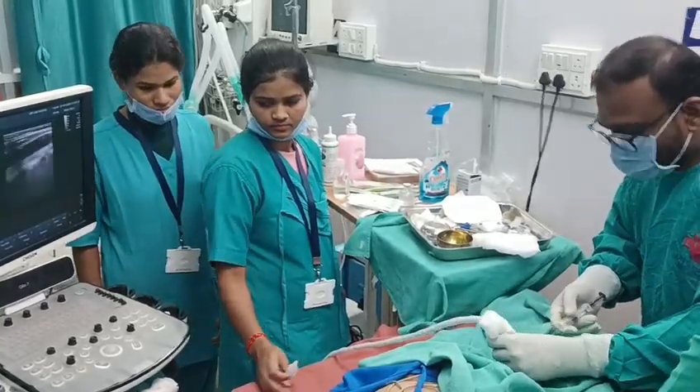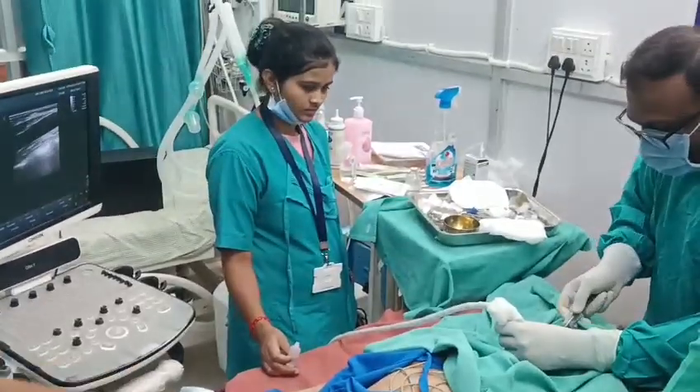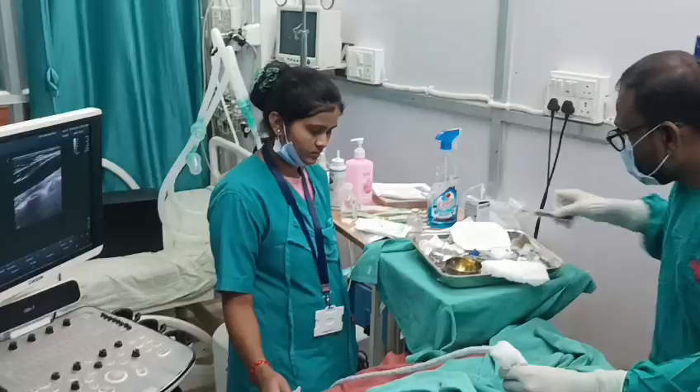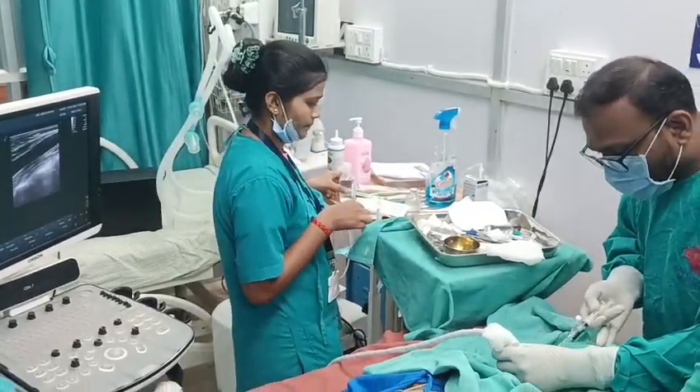In this view, I am given just some local anesthesia. Local done. I will proceed for cannulation.